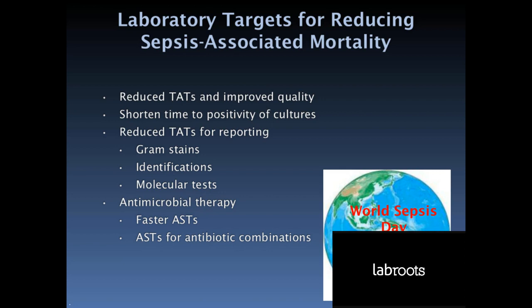That is an art that's not as strong these days as it used to be, and you may have to train people how to read zones more accurately. But I think it's a beautiful test. We actually used it on a total laboratory automation system.